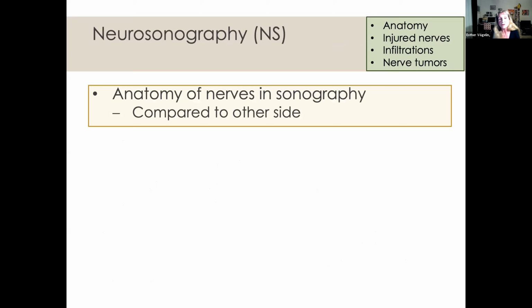But we have one good thing in the hand and in the legs. We have the possibility to compare our findings with the healthy or uninvolved other side. And please always use that, because you get a good comparison and you learn a lot about what is normal and what is abnormal.